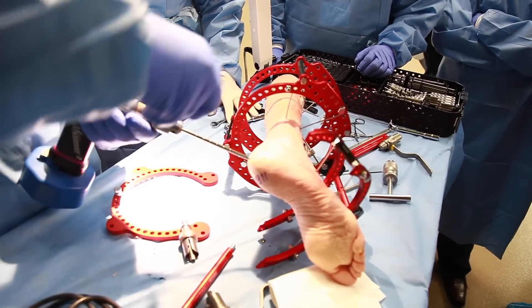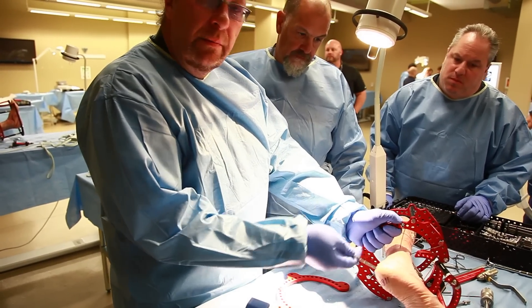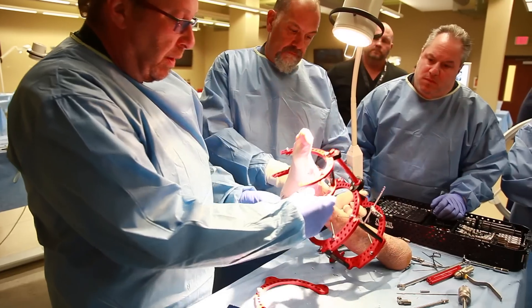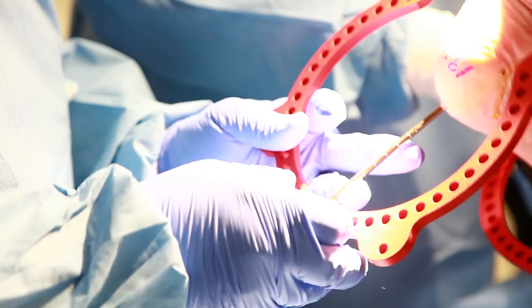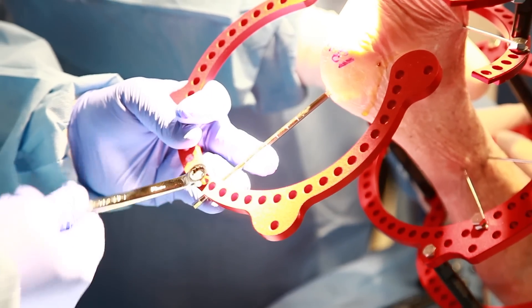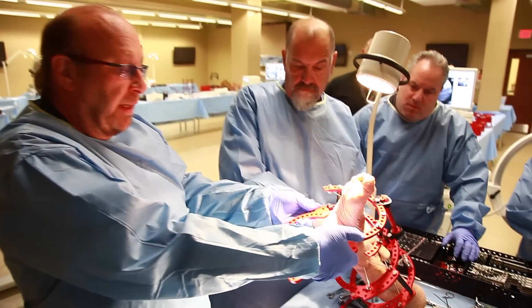Then the rear moves. This will now act as a joystick that I can move the calcaneus in any direction I want. By attaching it to this ring here, I can now — just like the pilot of an airplane — fly the calcaneus into whatever position I want. Under fluoroscopy, I'll get that completely reduced.